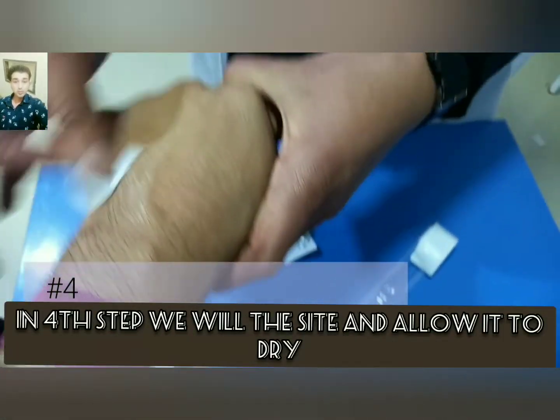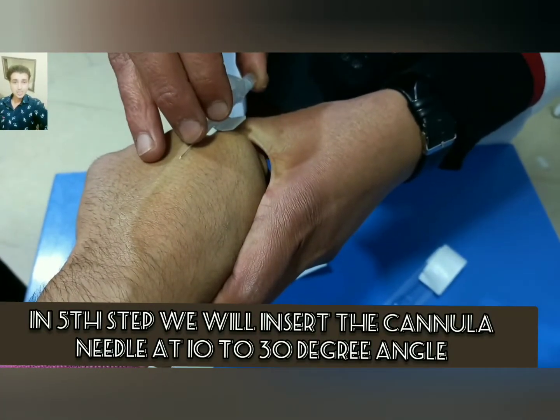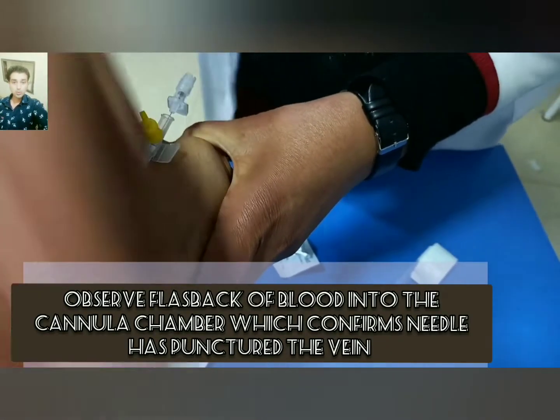In the fourth step, we will clean the site and allow it to dry. In the fifth step, we will insert the cannula needle at a 10 to 30 degree angle and observe flashback of blood into the cannula channel.